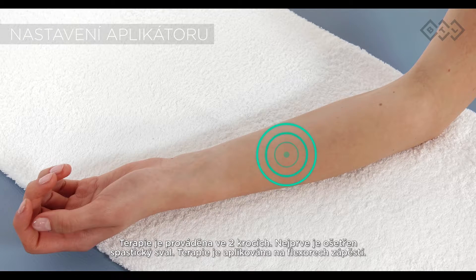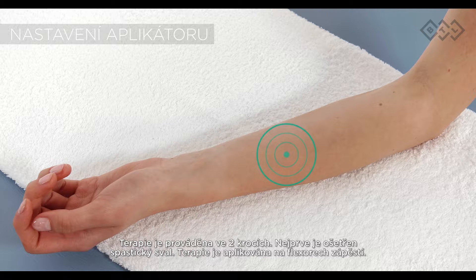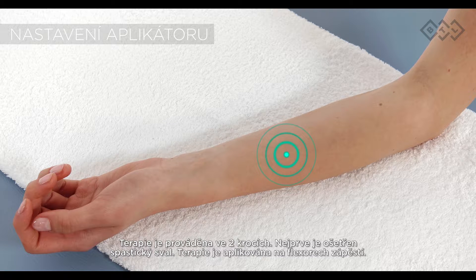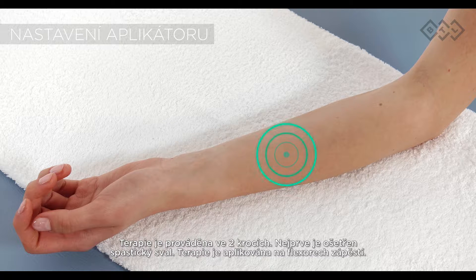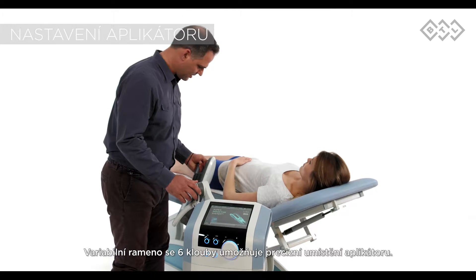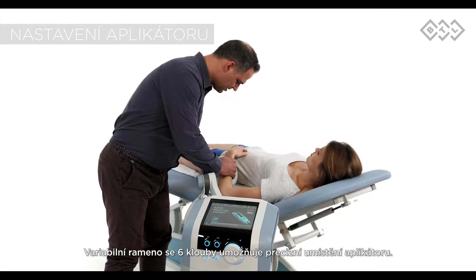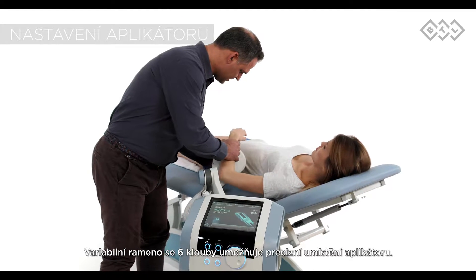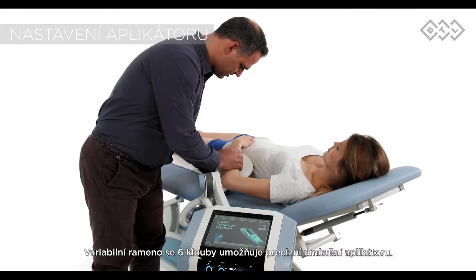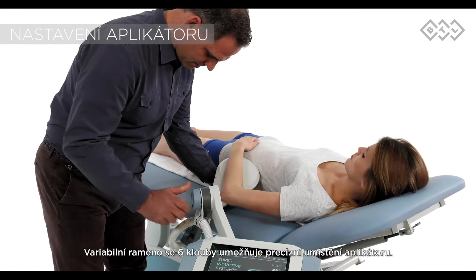The therapy is done in two steps. First, the spastic muscles are treated, with therapy done above the flexors of the wrist. Place the applicator above the area to be treated. The device is easily positioned by means of the six-joint arm, which allows for a precise setting.